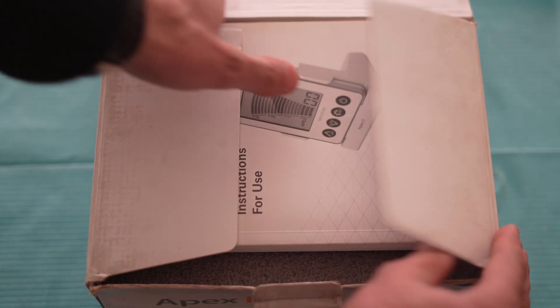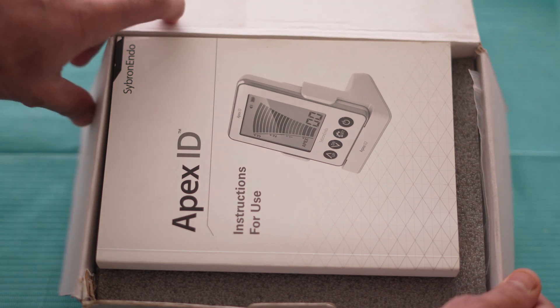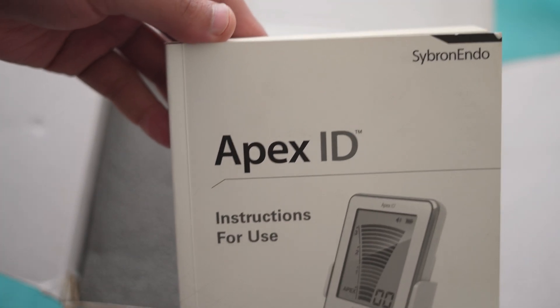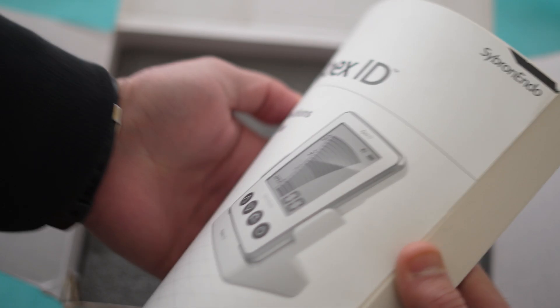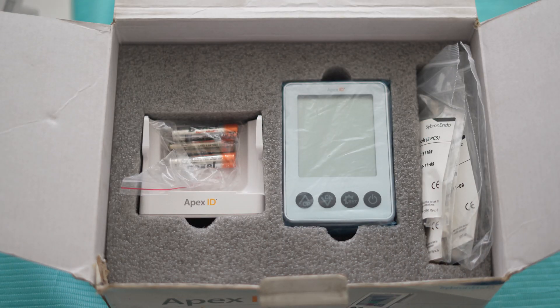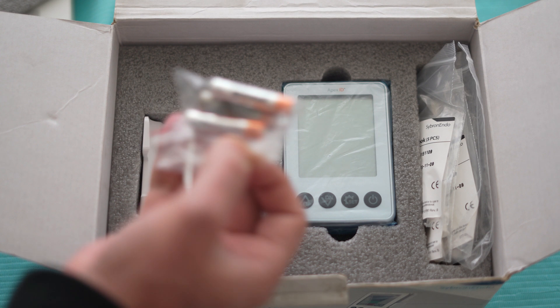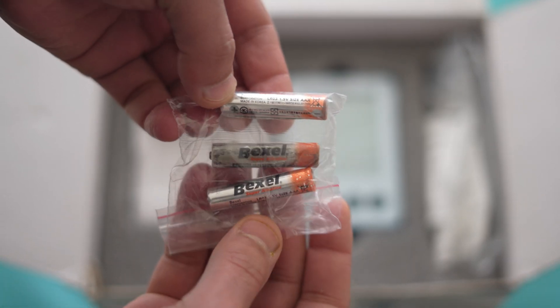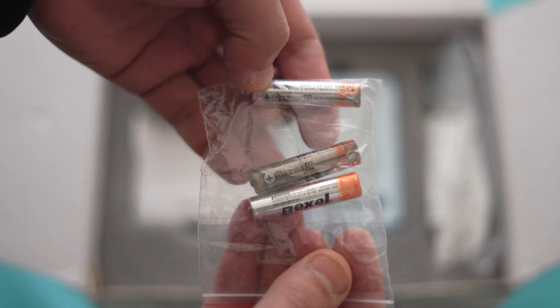Here I can see the instruction manual — this is the Apex ID instruction manual that explains how to use this Apex locator. Everything is mentioned in this manual. Next inside the box I can see three alkaline batteries: three AAA 1.5V batteries on which the Apex locator can work up to 70 hours.